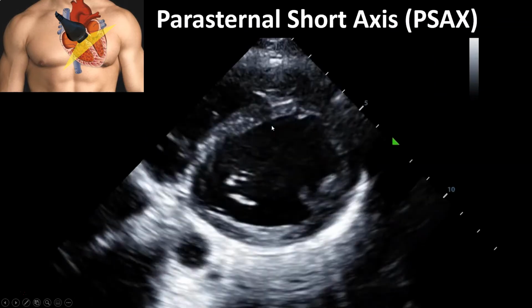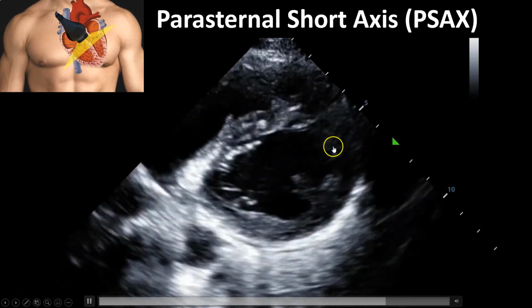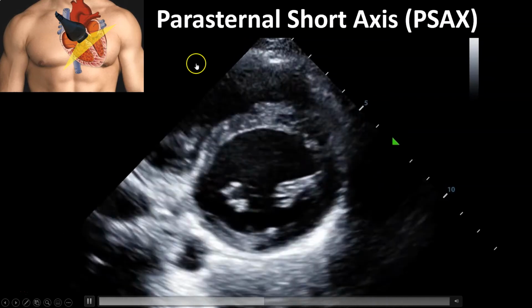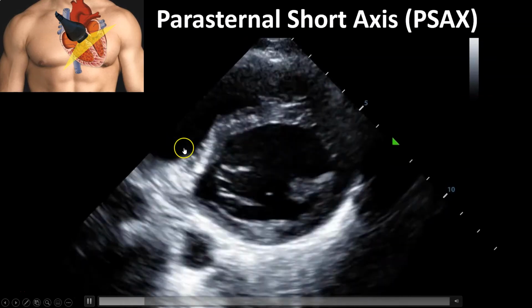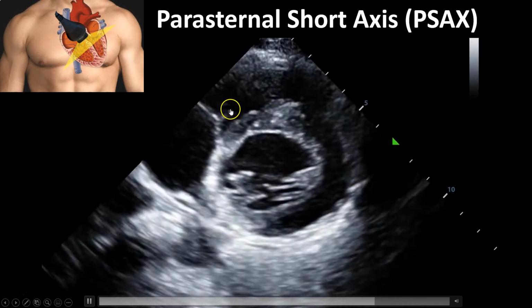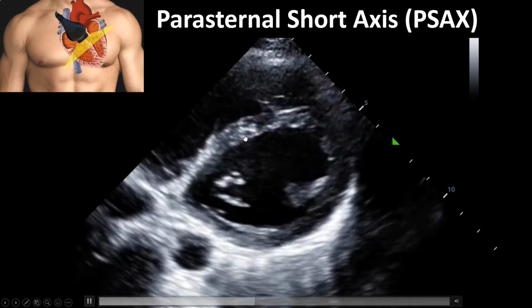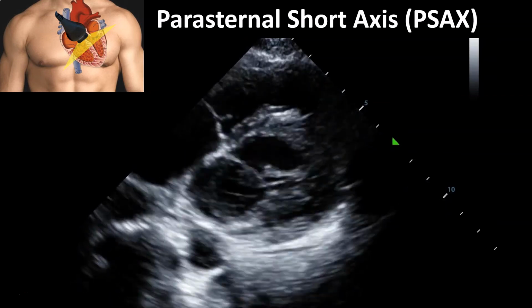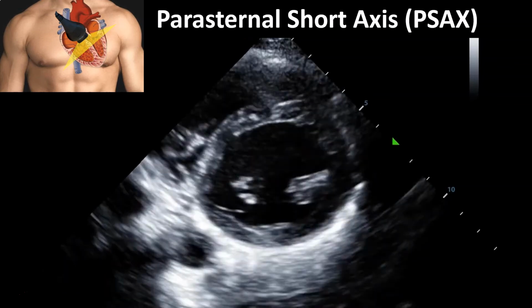And when you're watching it, this is what the heart will look like. You'll see a nice crisp endocardial border there, myocardium there, and the right ventricle there. Technically the right ventricular outflow tract, you can tell because right there is your pulmonic valve. As the heart is beating, this view is great to look for any evidence of a depressed ejection fraction, or if you're being particularly fancy, like one of my fellows should be at this point, looking for regional wall motion abnormalities.